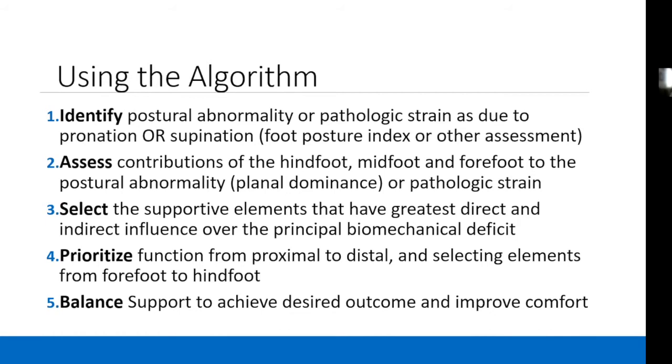Second, to assess the contribution of the hindfoot, midfoot, and forefoot to that postural abnormality through what's called planal dominance. Some of these concepts come from podiatry, by the way, for the pathologic strain. Then to select the supportive elements that may have the greatest direct and indirect influence over the principal biomechanical deficits.